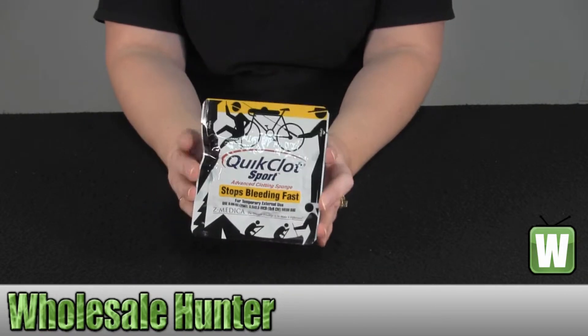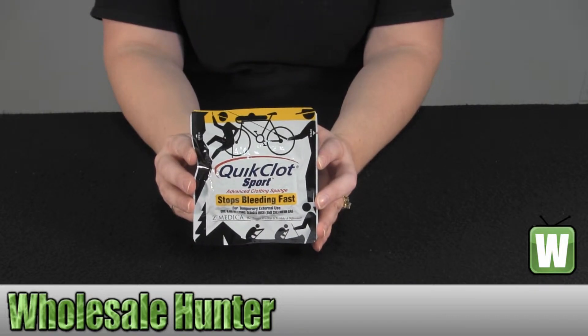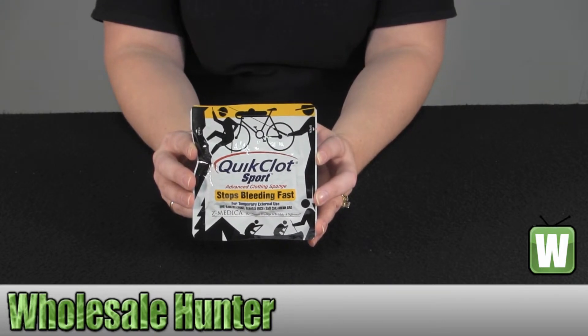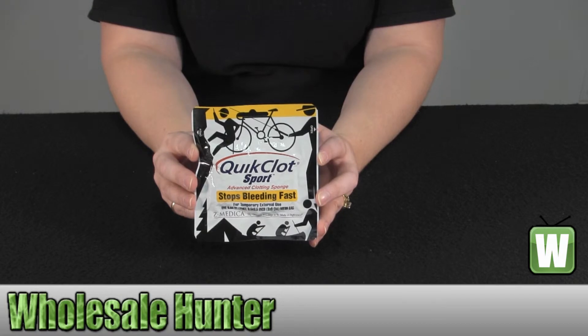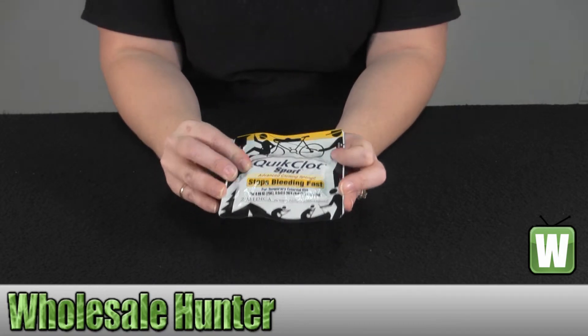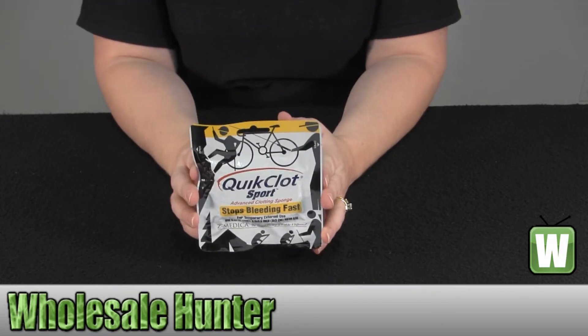The Quick Clot is a chemically inert material in a mesh bag. It speeds up the coagulation of blood, resulting in a stable clot, and stops bleeding. It stops the bleeding quicker than a conventional method and is safe to leave on your wounds until advanced medical care arrives. It is a three and a half by three and a half, 25 gram bag.